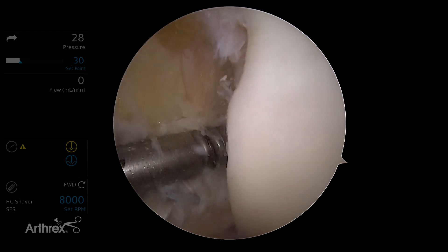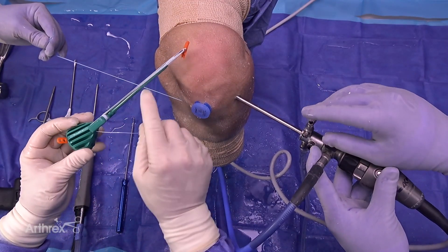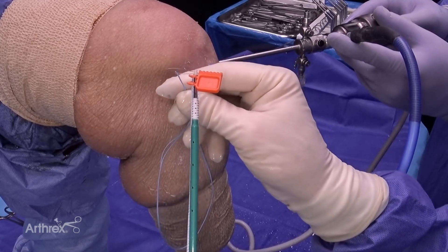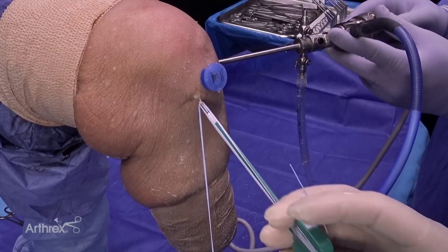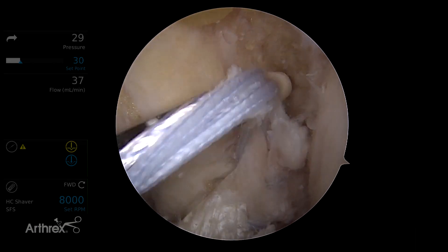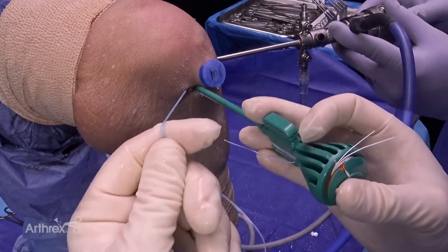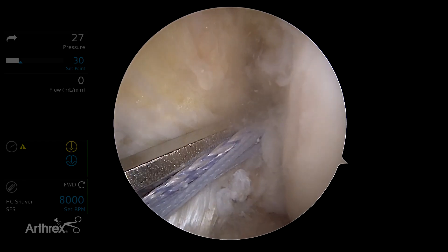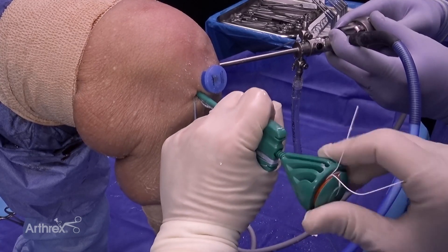Follow that up with the tap. This time we're going to use a preloaded 4.75 biocomposite swivel lock with fiber tape, which we'll use for our internal brace. Load our fiber wires through the eyelet and follow ourselves up. We're going to get the tension out of the system by cinching it up — get the eyelet right up by the mouth of that tunnel, let go of our hand, and anchor it in nicely. If you watch the end of the ligament distally, you'll see it tighten up nicely. Now it's just a matter of deploying our swivel lock.